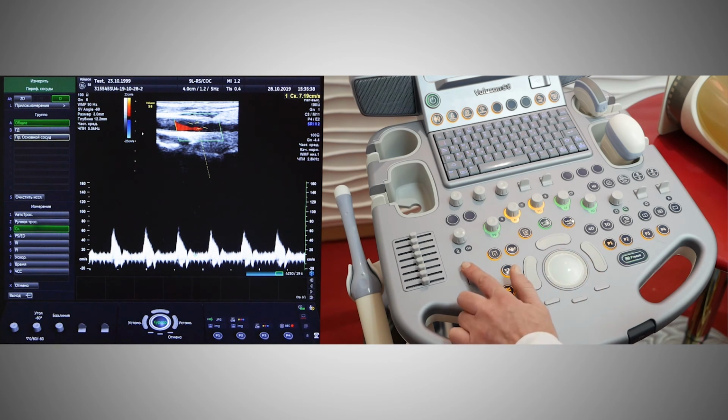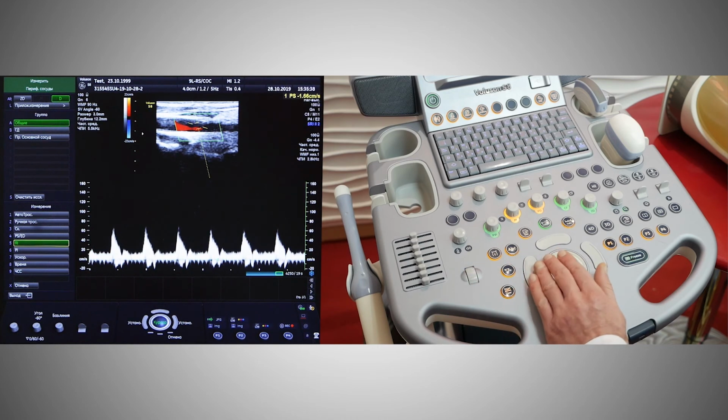Right here we can choose auto tracing. We will get the result. We can perform manual tracing, pulse index measurements, resistance index. It's measurements which enables us to examine all vessels in pulsed wave Doppler mode.